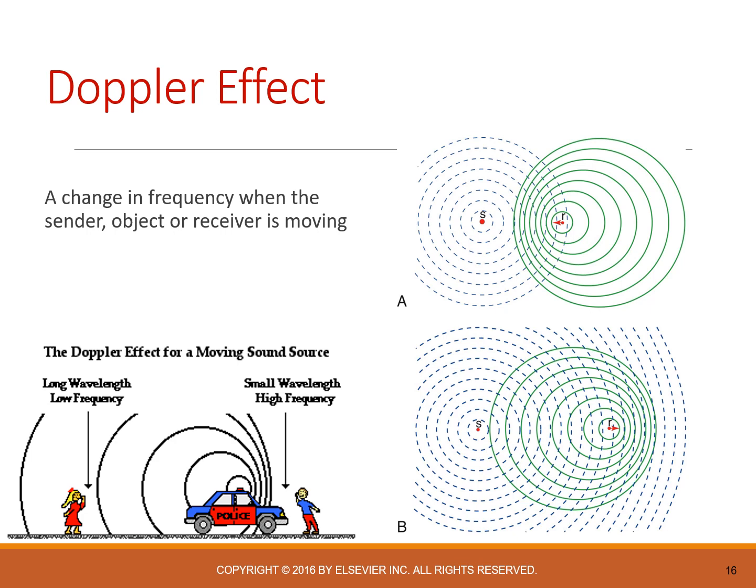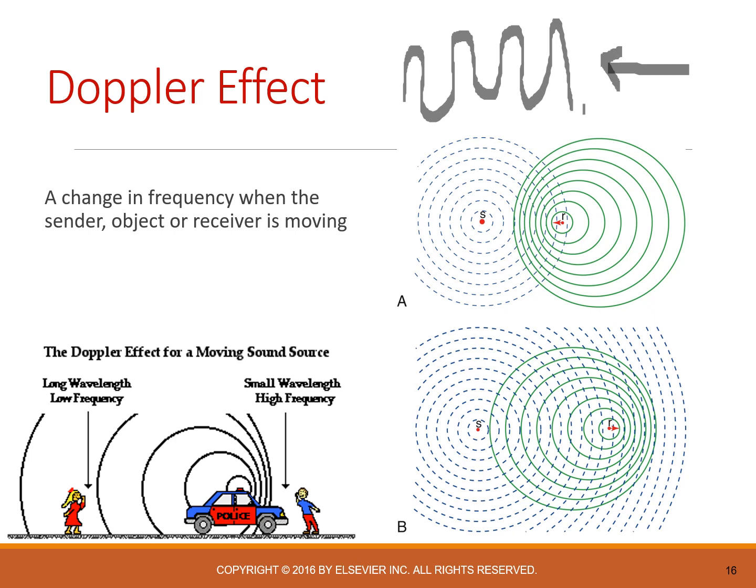The Doppler effect is how we get the data in order to determine velocities and movement of blood and direction of flow. The Doppler effect is really pretty simple. I'm sure you all are aware, this is how police officers would detect your speed. What we do is we use sound, and we direct that sound towards a reflector, in this case, your blood cells. If you've already taken the physics component of the point of care, you'll remember that ultrasound is always traveling in a frequency. As I emit that sound wave to a moving object, it is going to crash in and interact with it.